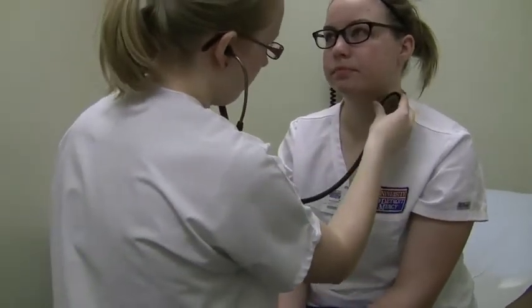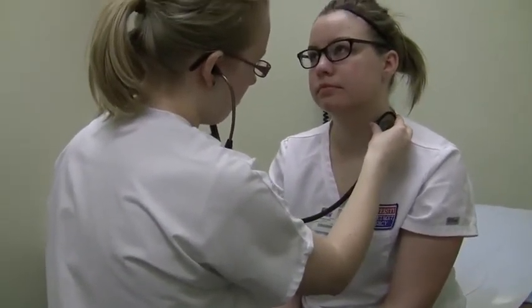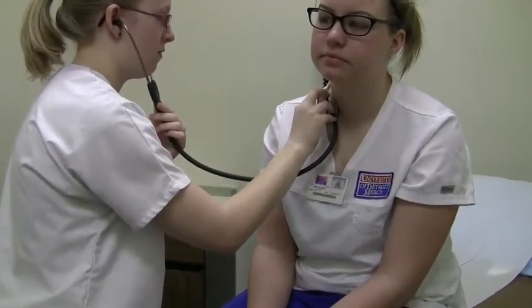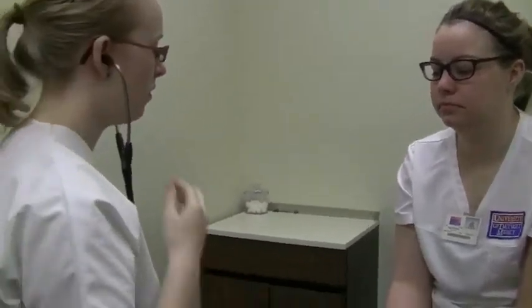Now I'm going to move to the neck. I'm just going to feel for your pulses, okay? Okay. Her left carotid is a 2+. And so is her right. Okay, now I'm going to listen to them for any bruit. When I put my stethoscope bell at different points, just hold your breath for a few seconds, okay? Okay, I'll let you take a little breath. And same thing for the other side. Perfect. Thank you. Okay.